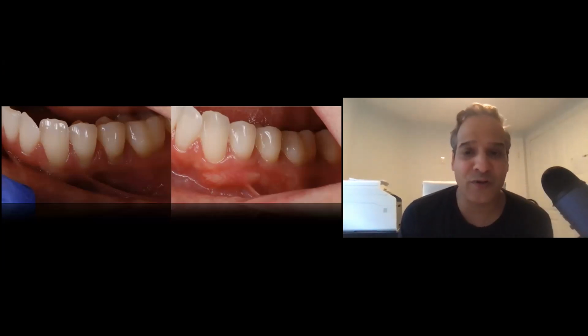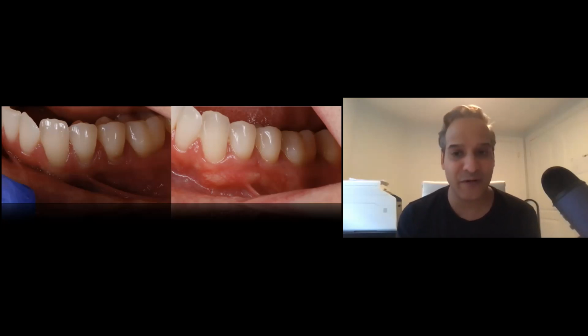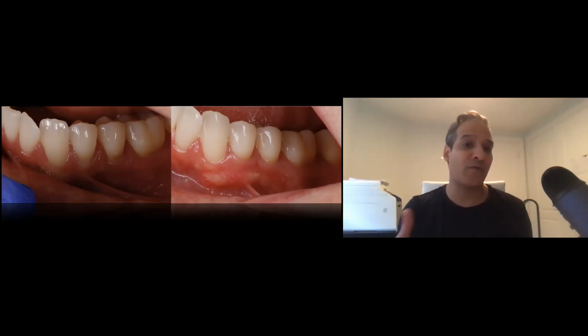Okay, and I want you to notice where the frenum is from the before and after. So when we release the flap, you can actually release the level of the frenum and put it more apically without having to really cut it from the outside. It's just a periosteal release. I do it over that frenum so that it stretches and then it ends up being positioned more apically.